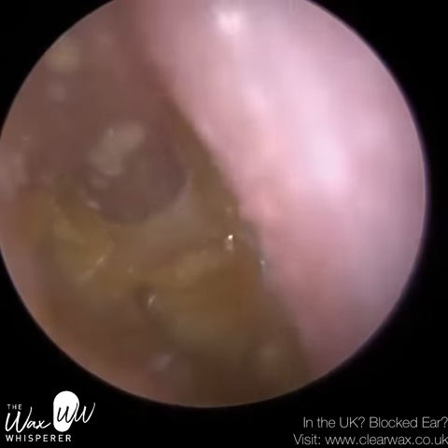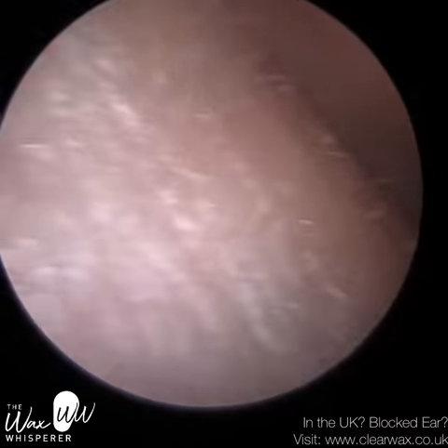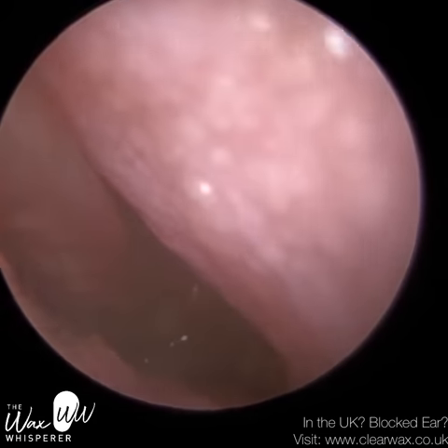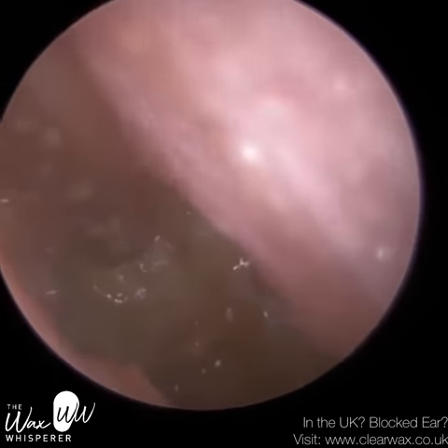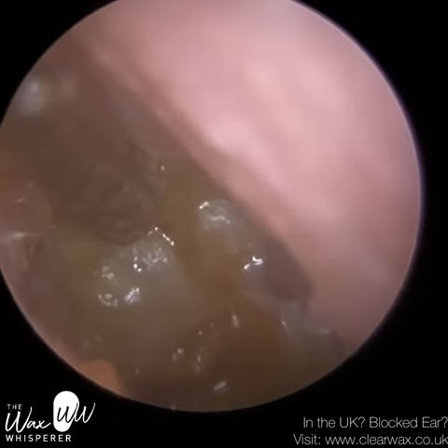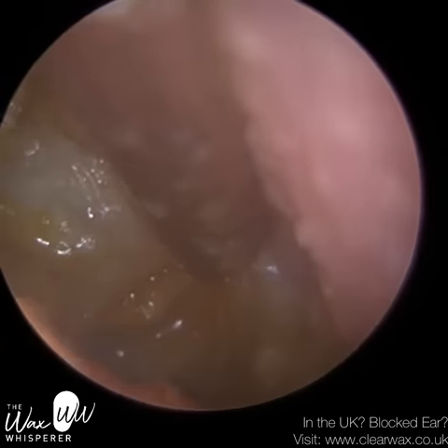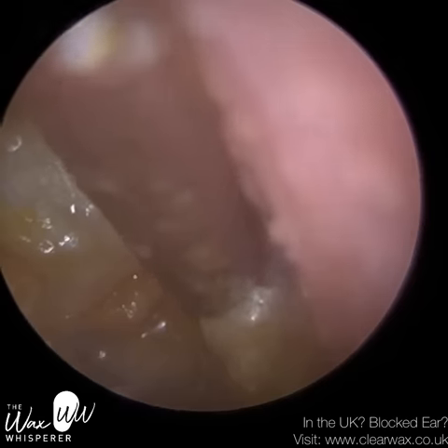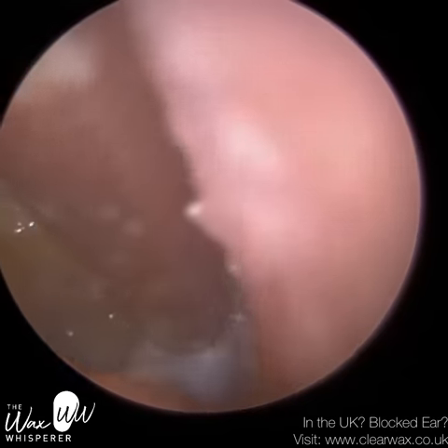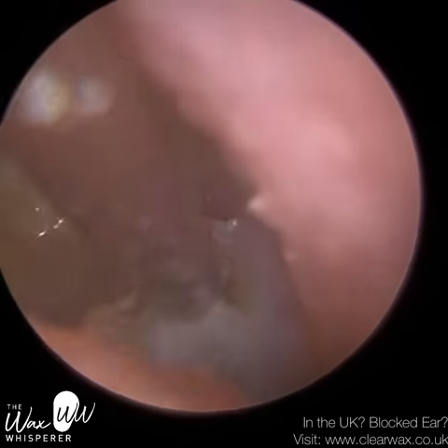I think it was sodium bicarbonate drops I put in for this. Once more, a speculum wouldn't dilate this patient's ear canal — the swelling is too deep. For surgery, it may be different — a speculum used when the patient is asleep under anaesthetic can be longer, and if the patient is anaesthetised they're not going to feel the pain.